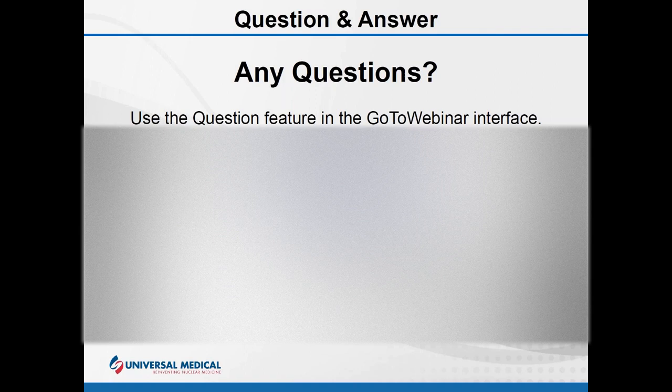Okay, great. And so what is the difference between a nuclear scan and a PET scan? A nuclear scan, in both cases, the patient's injected with an isotope. In the case of a nuclear scan, the emission is a gamma ray. Gamma rays, think of it as, if I take a point in space, when a singular gamma ray emits, it goes in one direction, from that point in space out. Now, it can go out in any angle, but it's going out in one direction.